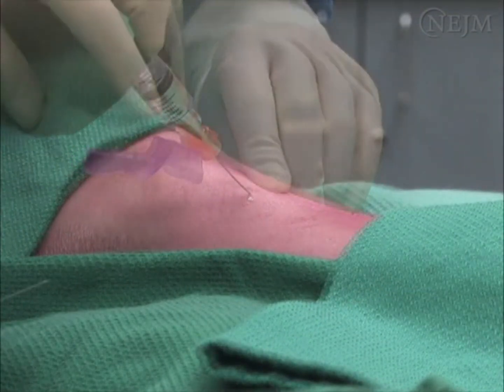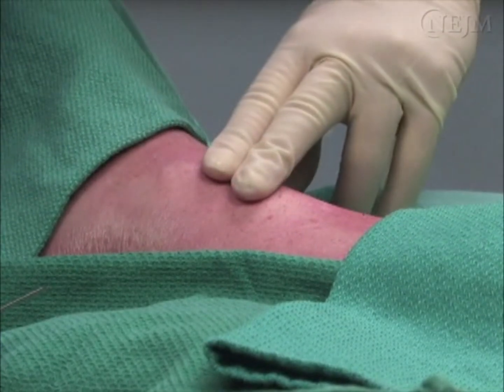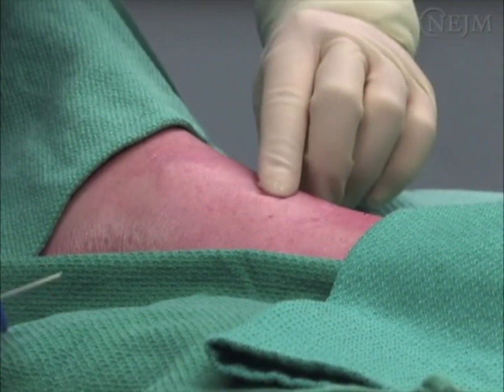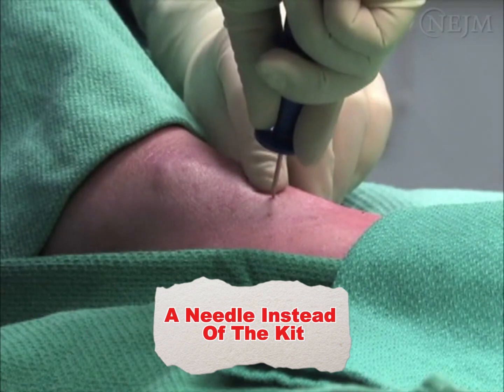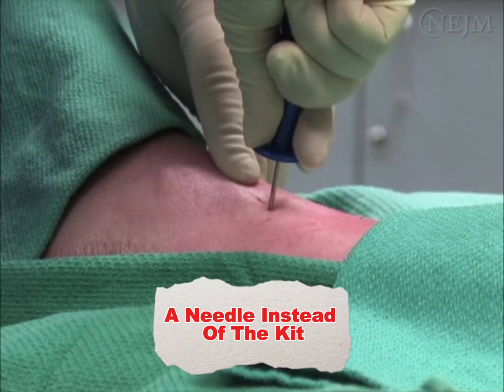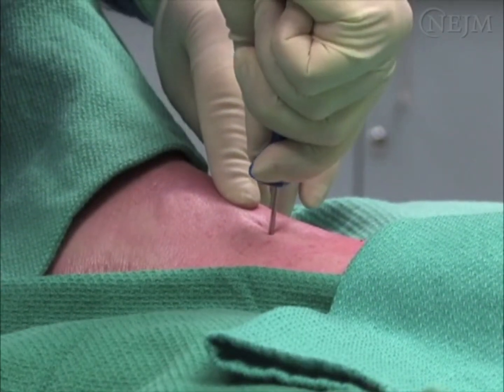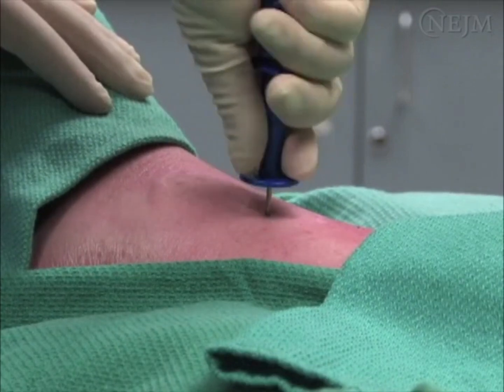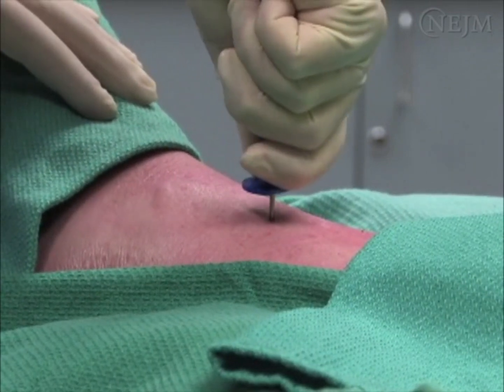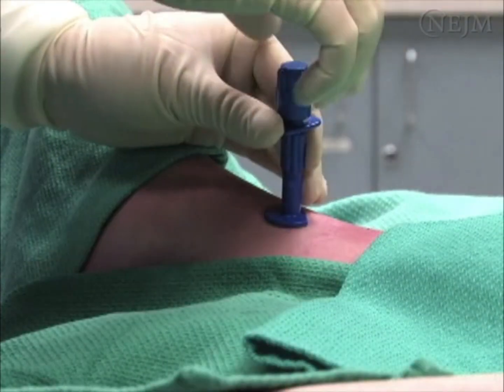Stabilize the leg with the non-dominant hand. Hold the needle in the palm of the dominant hand and position it at a 90-degree angle to the long axis of the bone. Advance the needle through the bony cortex with a twisting or rotating motion and steady pressure. You will encounter a great deal of resistance. A sudden loss of resistance indicates that the needle has penetrated the cortex and reached the medullary cavity.